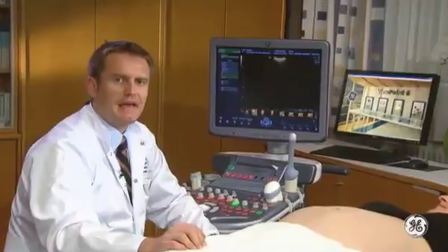When performing any ultrasound scan, one must be conscious that 40% of the information displayed on the monitor consists of noise. In the past, examiners got used to the presence of that noise and took it as a constant element of ultrasound imaging. Nowadays, thanks to algorithms that improve the signal-to-noise ratio, it is possible to eliminate most of the speckles and thereby improve tissue differentiation.